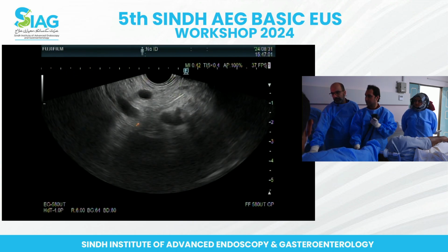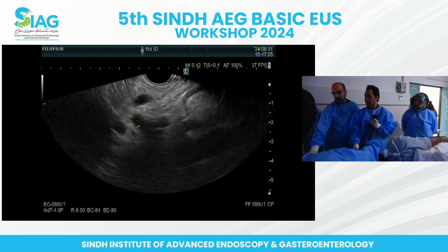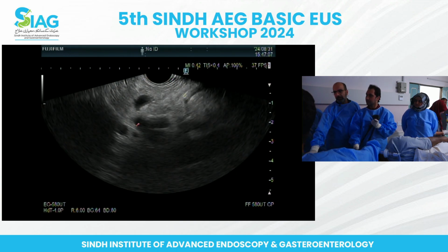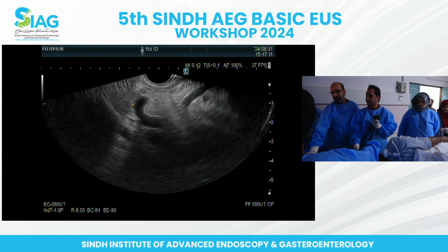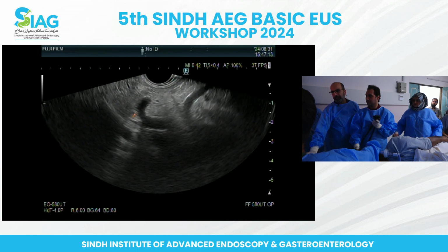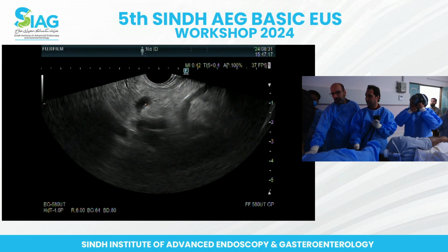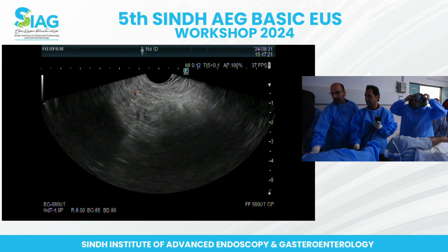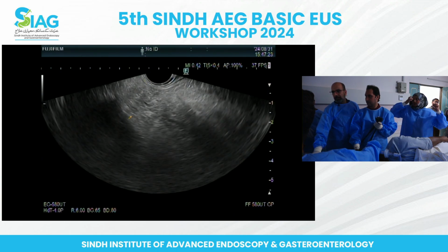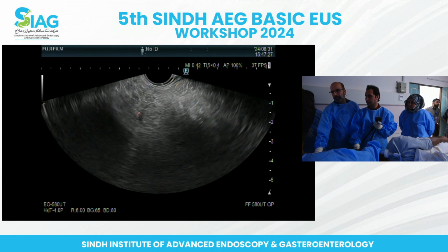Keep spinning. Right there, you see that's the splenic artery. So now you keep following these, keep following. Actually that was hepatic and that's splenic. And there's your pancreatic duct coming into view. So keep following it forwards, relax your big wheel, and it'll drop the pancreas down this way. But don't lose the artery. So relax it, so find the artery again.